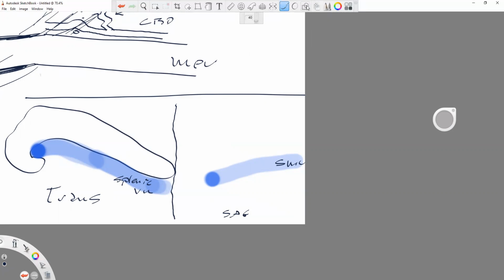If I take a plane of section right there, okay? If I turn from transverse to sagittal, and my plane of section is through, basically, the head, the superior mesenteric vein, or the confluence, and then through the uncinate process, that means on my sagittal image, I'm going to see something more or less like this. I'm not going to see something quite like that because that is not the right structure.